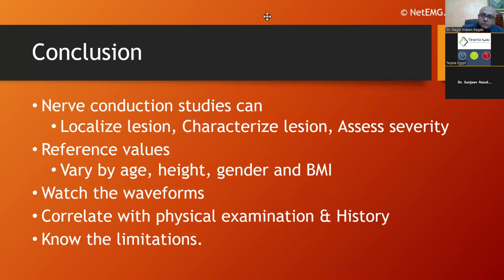And typically, the repeater F wave tends to have a normal latency compared to an A wave, because the repeater F wave is actually going all the way to the spinal cord and coming back. So it is buried within the F waves. The A wave is typically generated somewhere along the nerve, not all the way to the spinal cord. And so that tends to have usually a short latency. So those are the two things that will differentiate it.